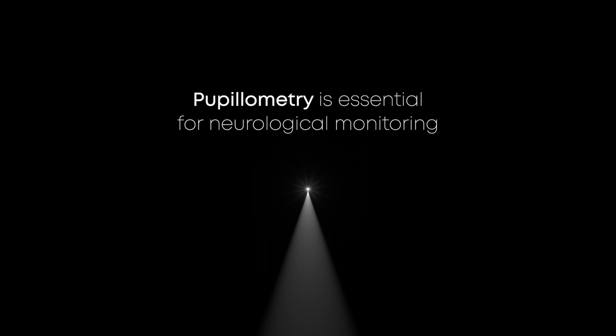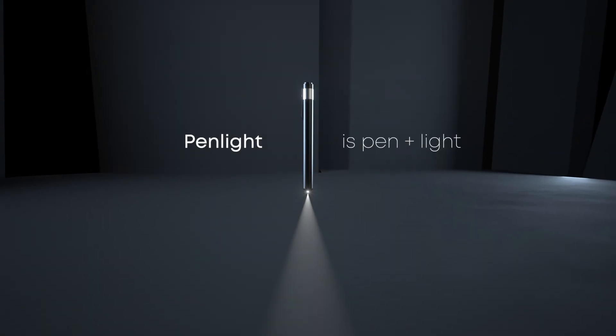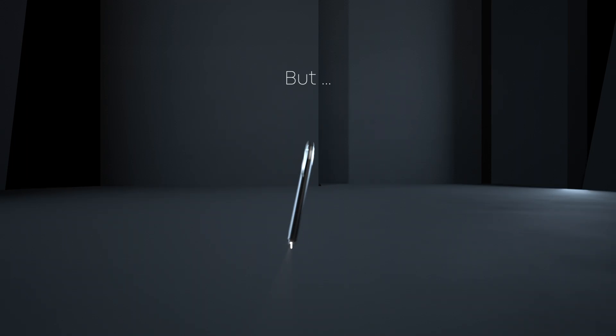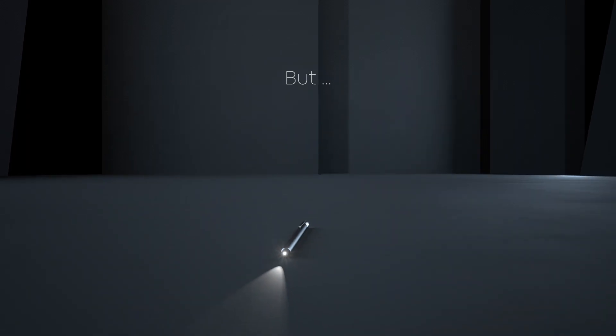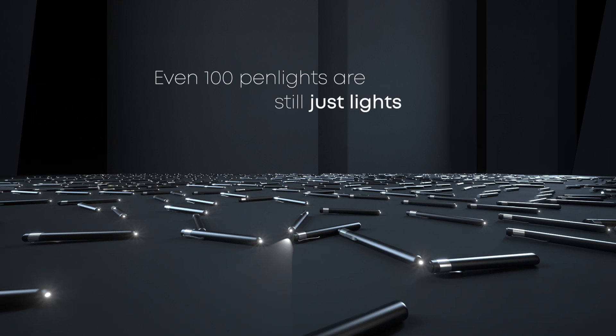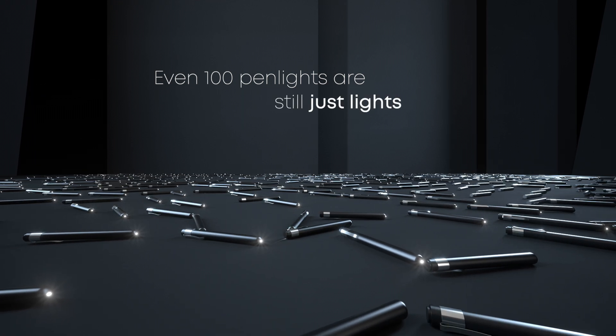For decades, the penlight has been used to evaluate neurological function. It helped a lot of people, but even a hundred penlights in the end are still just lights. It's time for something more, something more precise and objective.